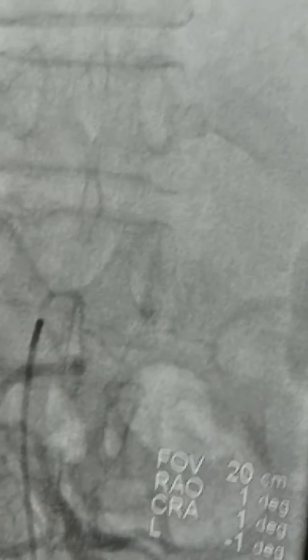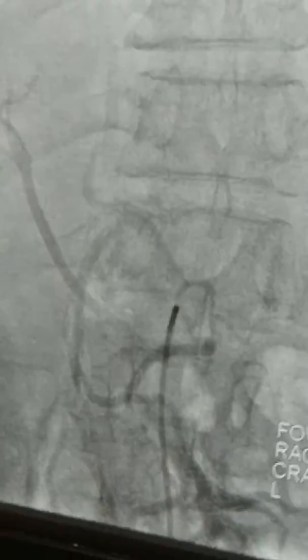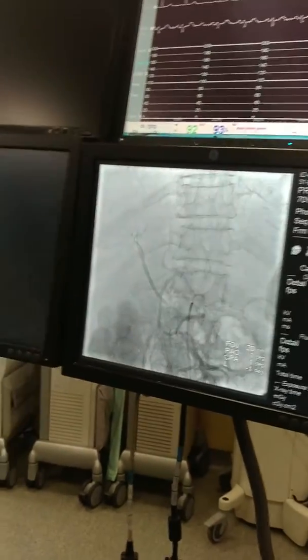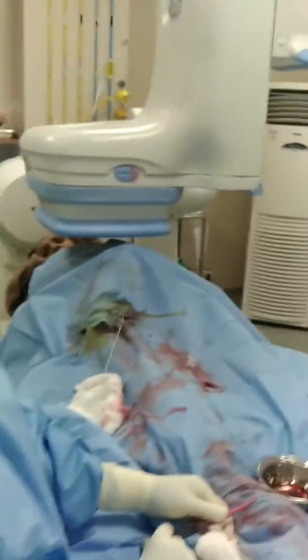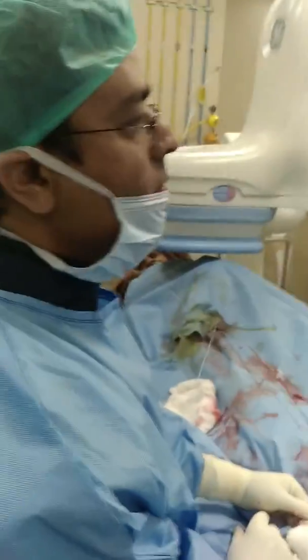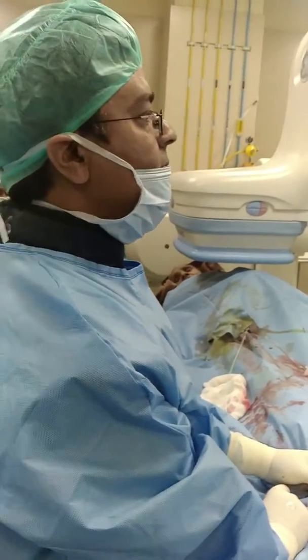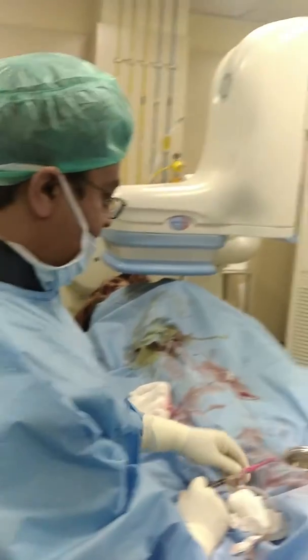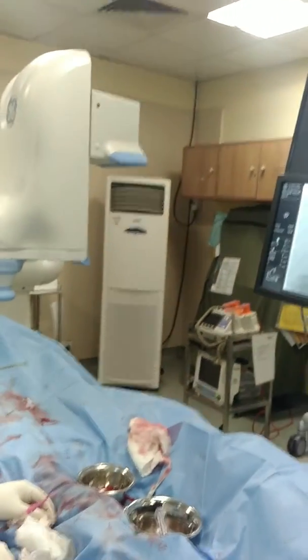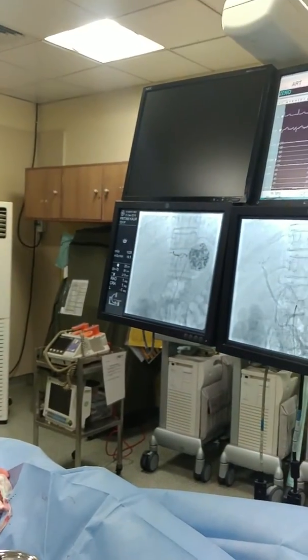Complicated arteries communicating through — the right hepatic is arising from the superior mesenteric artery. When we take a run of the celiac trunk here, we see that the splenic artery is not filling easily through the celiac trunk. So the catheterization was just difficult the whole time.